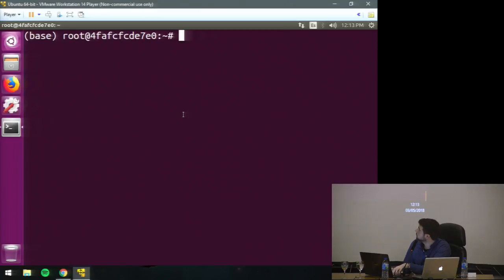So let me show you. If I run Jupyter Lab to the port 0.0.0.0, because I want this Jupyter Lab server to work with the internet browser that I'm using outside the container. I don't want to be writing all the time inside this shell. Otherwise, it's going to be super difficult to get anything complex done.